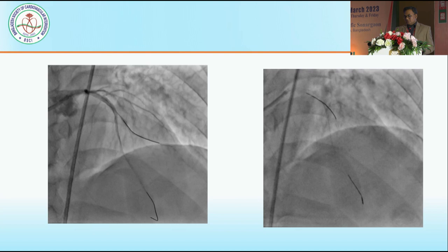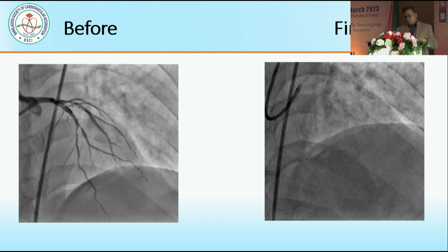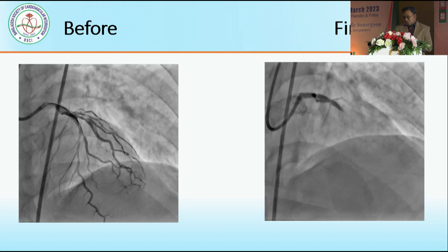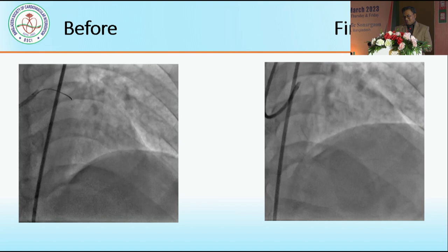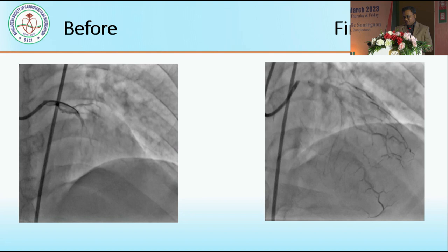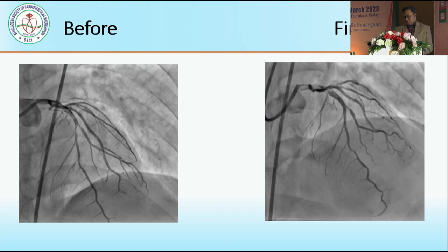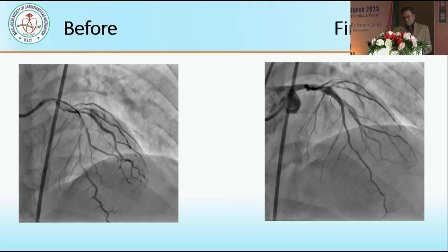At that point we took out the LAD diagonal wire. As Dr. Shamswarwar mentioned, we have to consider the side branch — we are very cautiously looking at what will happen there. We considered that the side branch is as before, with no extra compromise of the side branch supply. So we try to keep it simple — the side branch has TIMI flow as previously shown. Here we conclude the case.